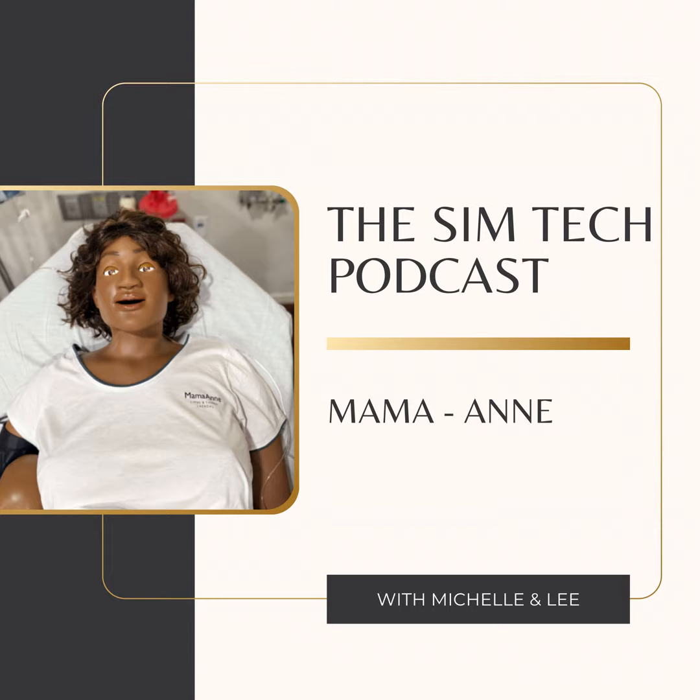Then if you need to, you can put, no, please show me how, and then it will give you a demonstration of how you place the baby in. Okay, but what I'm going to do is I'm just going to show you how you place the baby in. For those of you that know what Sim Mom looks like, she's very different from her, and everything kind of clicks into place as opposed to lots of different working parts.